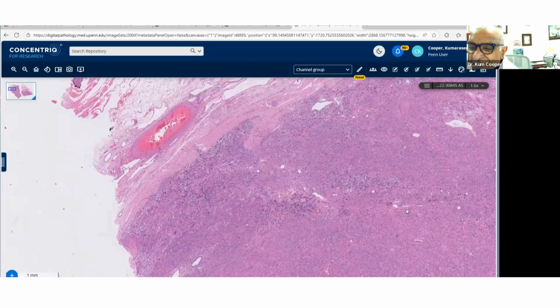So synovial sarcoma, let's start. I'm just starting at the bottom and moving upwards, not literally picking on anybody. Oh, there's a schwannoma that just appeared as well. So we've got smooth muscle, we've got nerve sheath, we've got synovial, we've got GIST. That's a good start, and it leads itself to a panel of markers that one would use. And for schwannoma, obviously, most of you know.